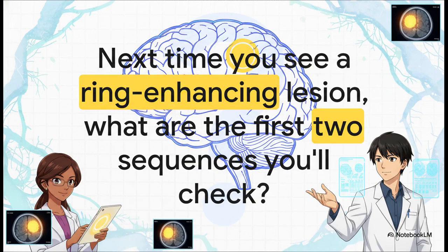That's the playbook. Now, the next time that scan pops up at 3 in the morning and you see that ring-enhancing lesion, what are the first two sequences you are going to look at to absolutely 100% nail the diagnosis? Yeah, you know the answer.